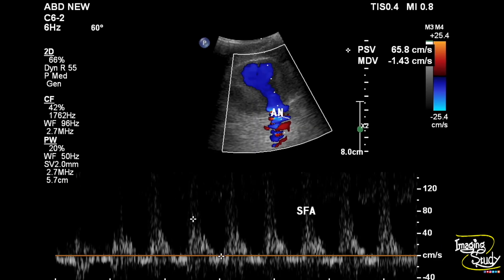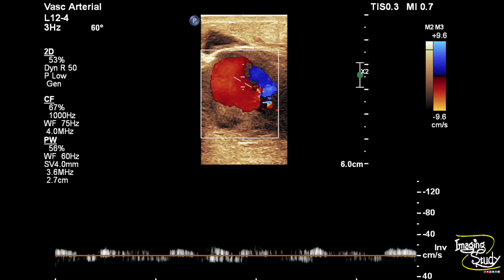Here you can see the flow pattern of the superficial femoral artery just at the junction, and here is the flow taken from the central part of the aneurysm showing a to-and-fro pattern.